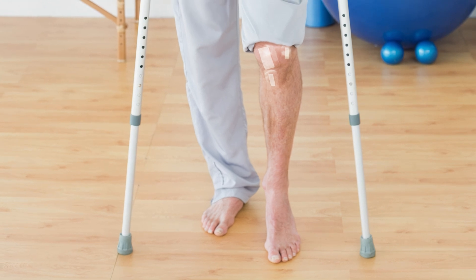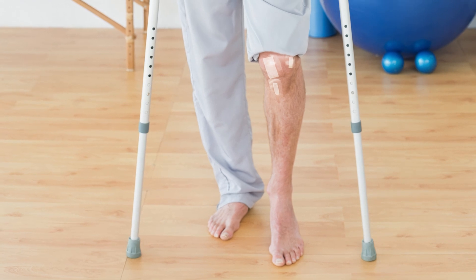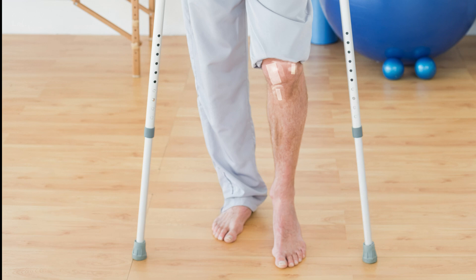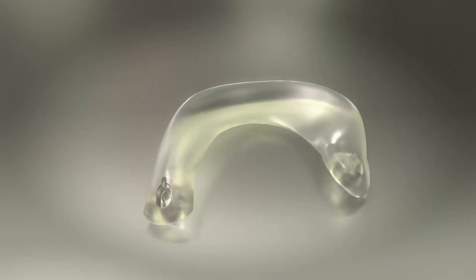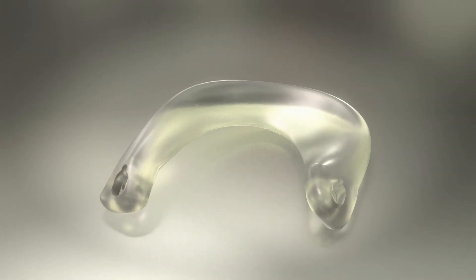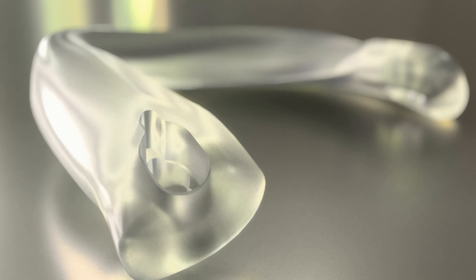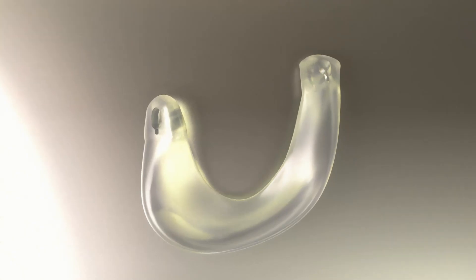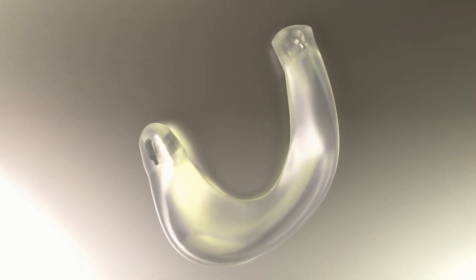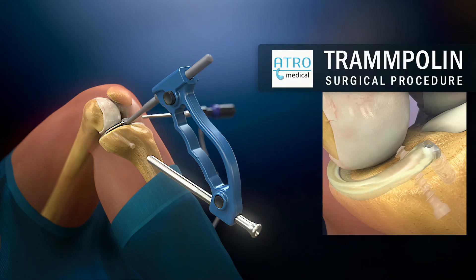The Trampolin meniscus prosthesis can provide full functionality from the moment of implantation after a rehab period of six weeks with 50% load-bearing by the use of crutches. The Trampolin meniscus prosthesis is a potential solution for medial compartment joint pain as a result of loss of meniscus function. Implantation of the Trampolin meniscus prosthesis and fixation screws is indicated for investigational use only and exclusively within the scope of approved clinical investigations.